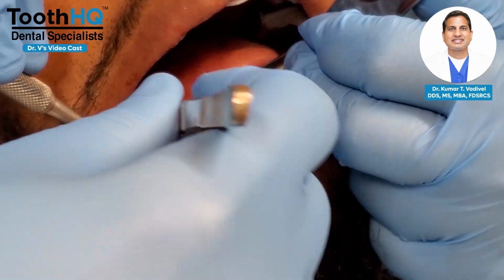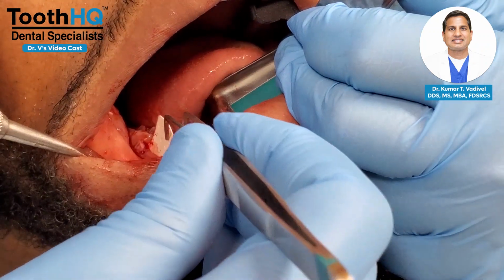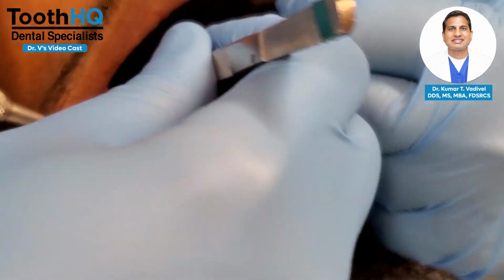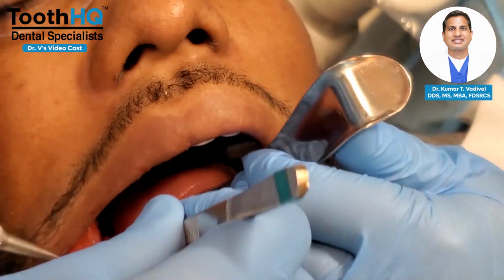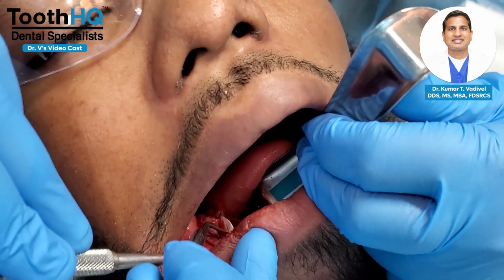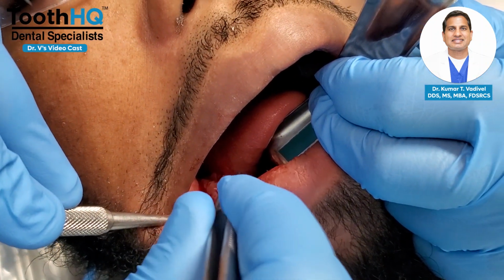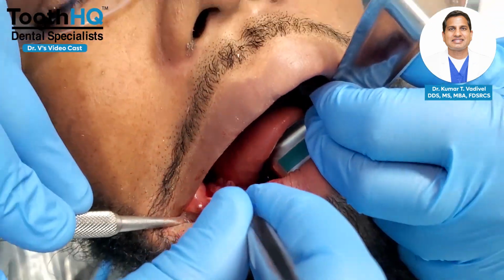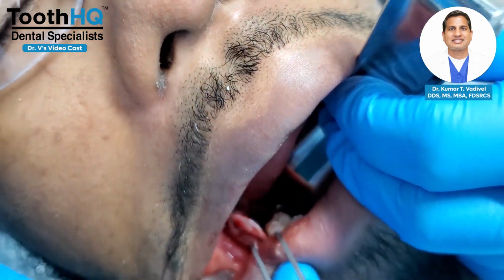And then after this, you want to make sure that you leave the membrane here on the buccal, but hold it all the way to the lingual to the degree that you are able to slide it under the lingual flap here. Can you guys see it okay? Yeah. Okay. So now the next step will be to put the bone graft and then slide the membrane to the lingual and then close it.